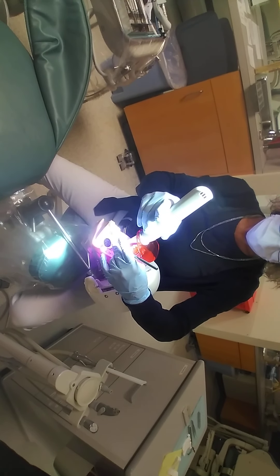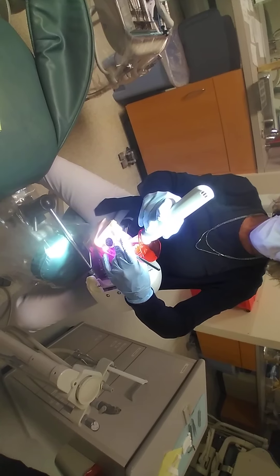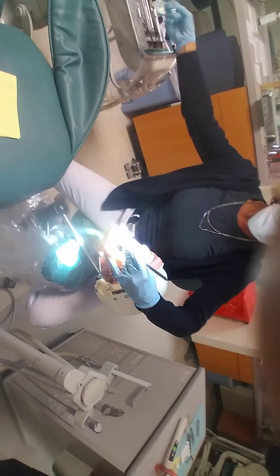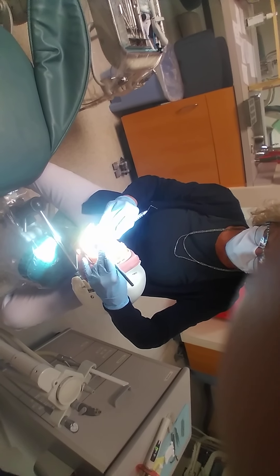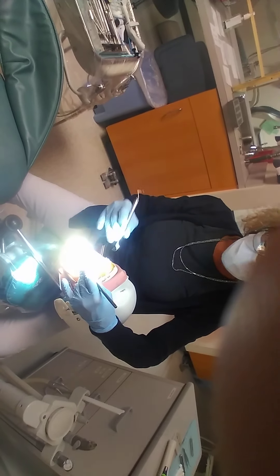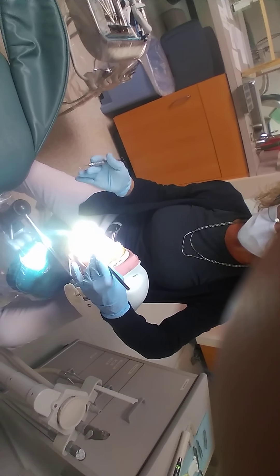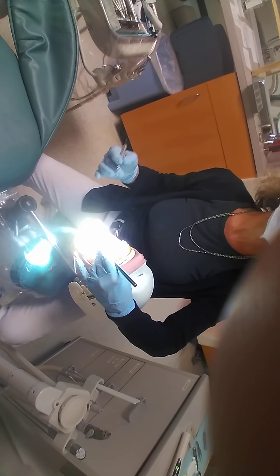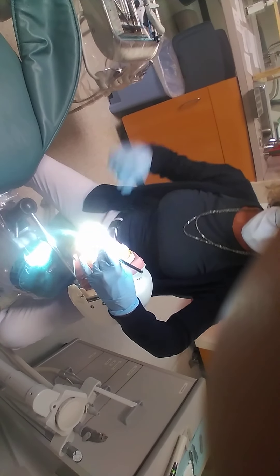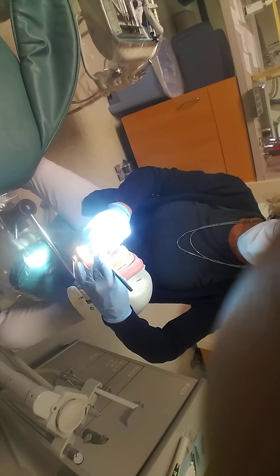Once it's cured for 20 seconds, I would take my explorer — because I think it's filled — and run it across the surface to make sure it's cured. If there's a void, I can easily add to it because I have my oxygen-inhibited layer, which is uncured resin acting as my bonding agent. Then I would wipe off the uncured resin, let my patient close, and do a lemon rinse to get that bitter taste out.